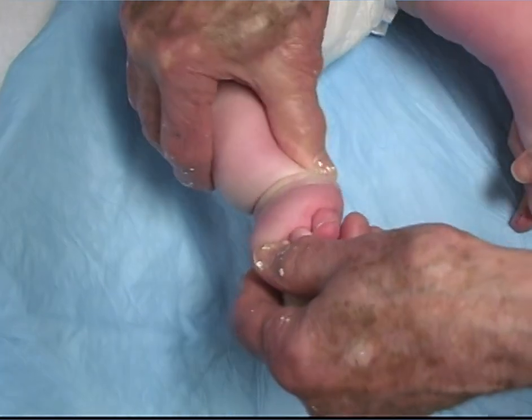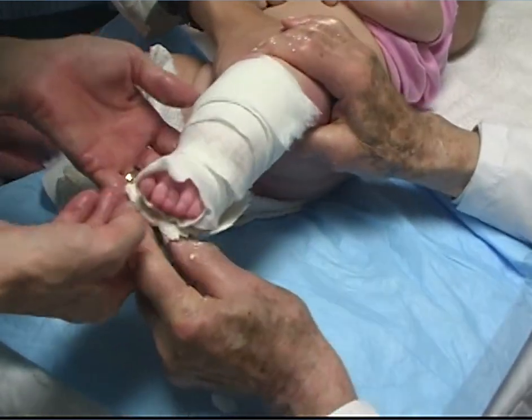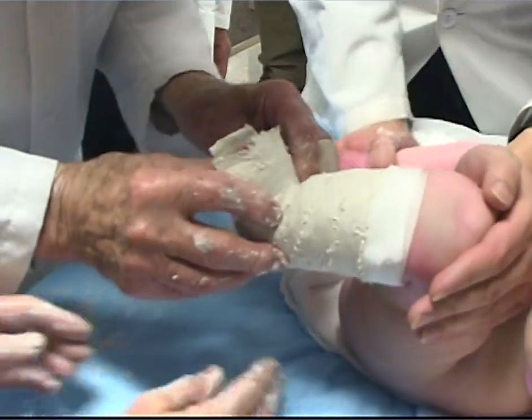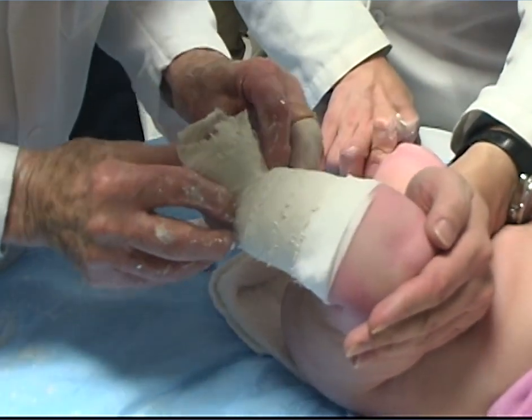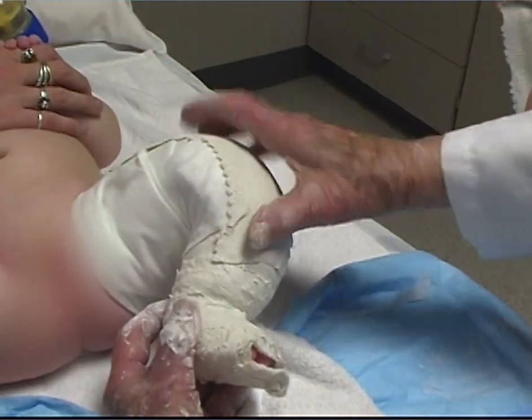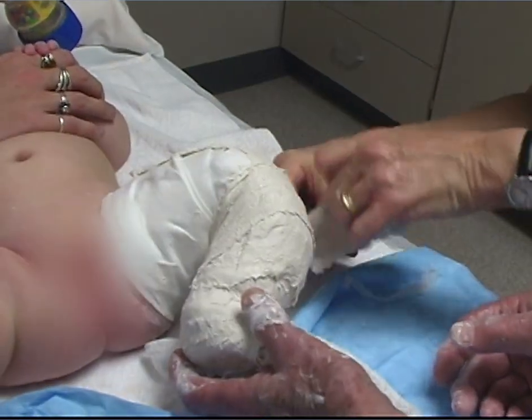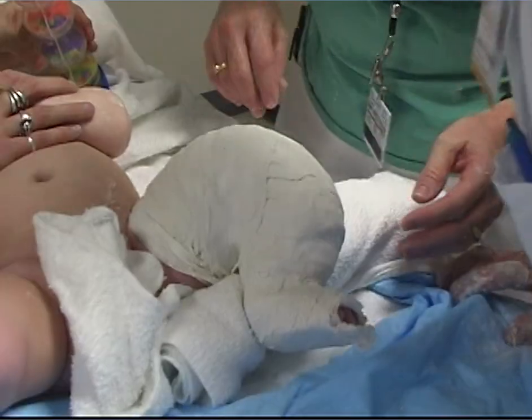With the heel varus corrected, a second plaster cast was applied using a posterior plaster splint over the calf, heel, and sole, reinforced by a well-molded plaster bandage. The cavus and equinus were corrected simultaneously by pushing with my thumbs under the metatarsals while an assistant stabilized the knee in flexion. With my fingers, I molded the plaster cast over the ankle. To prevent the cast from slipping, the knee was immobilized in 110 degrees of flexion by applying a plaster splint in front of the knee, reinforced with a plaster bandage around the thigh, thus avoiding excessive plaster behind the severely bent knee.